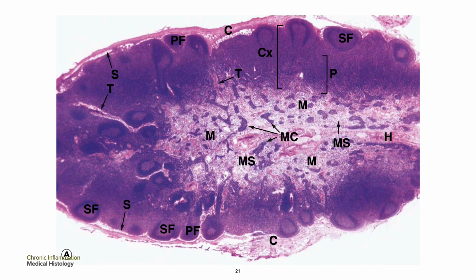This is the lymph node structure and the vascular organization. Take a look at this because we will be reviewing this in the immune system disorders and your immune system tissues, even in the hematopoietic and your immune system lecture presentation. This is in low power.